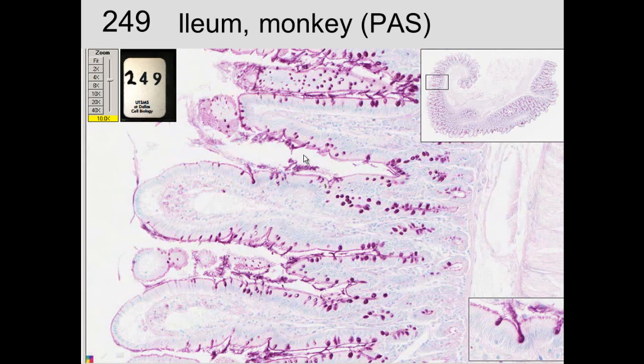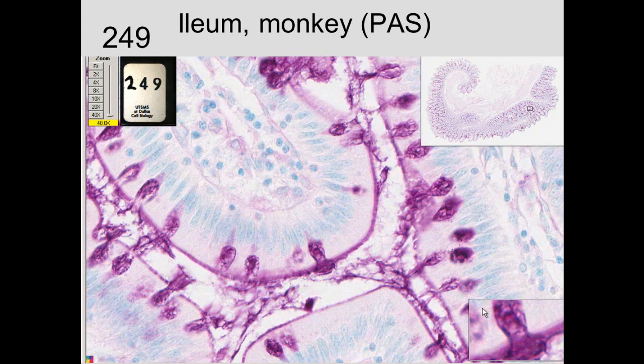And we can see that this is a stain to slide 249 with PAS staining, periodic acid-Schiff staining, and it shows you the goblet cells, which have a lot of carbohydrates inside there, and it also shows you the PAS positive brush border surrounding each of these intestinal absorptive cells. Intestinal absorptive cells run from here to there. So these are individual cells, and then these are nuclei of the individual cells in through there. So again, we can see the brush border and the goblet cells. Goblet cells, brush border is highly PAS positive.